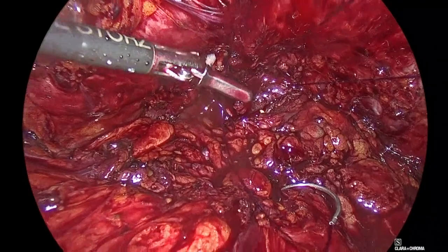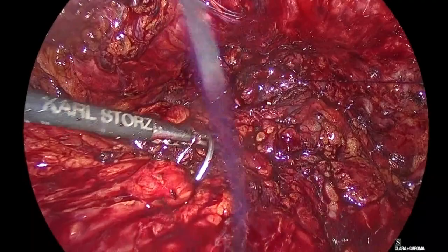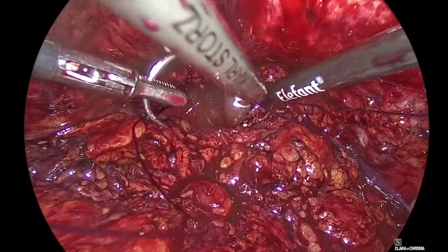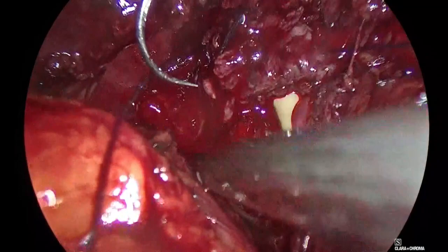And you start the suture at 7 o'clock rather than 6? I go at 7 with the needle, because I want my backhand to be more visible. When I go with my backhand, I want to have it more visible. So, check the catheter. That's why I start at 7. I find it easier to work forehand on the posterior layer. Okay, come in. Now, Panagiotis. Outside and inside. Good.